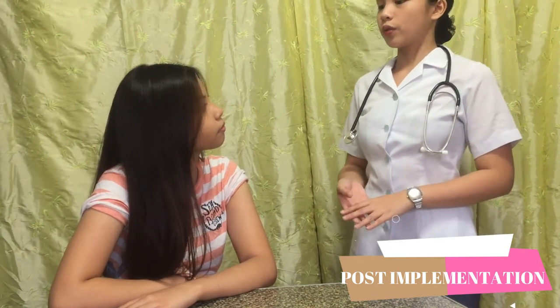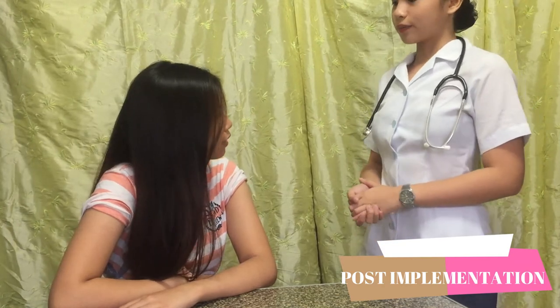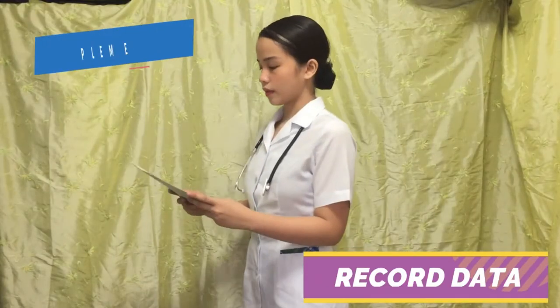So Lindsay, after assessing your blood pressure, it came out on both sides as normal. You have a reading of 120 over 80 mmHg. So thank you very much, Lindsay. Thank you very much.